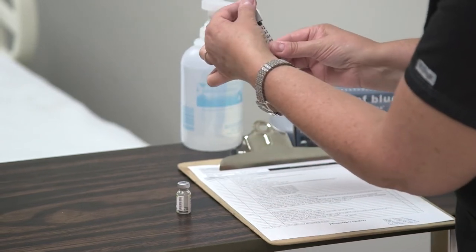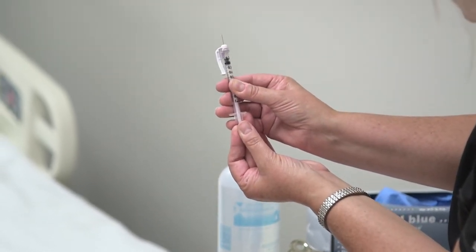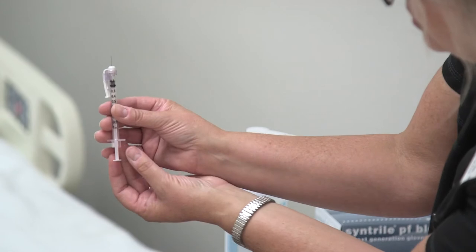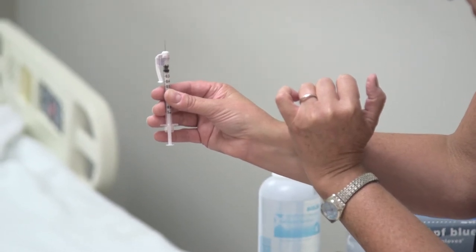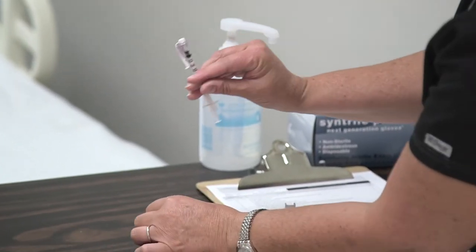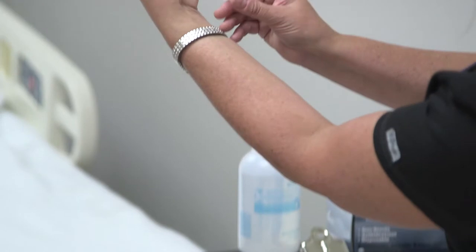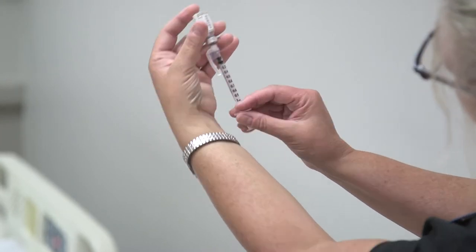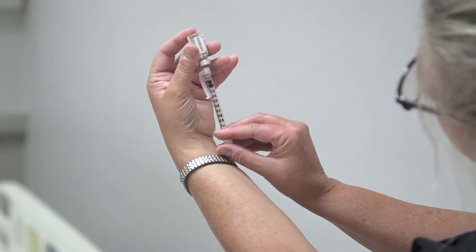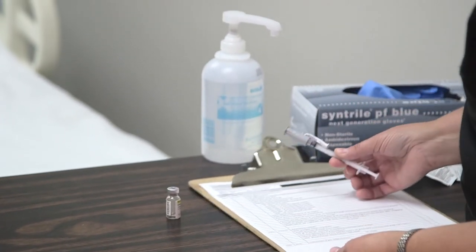Like other medications, we are going to draw up air first — just 0.1 milliliters. You can see the top of the plunger is right at the 0.1 mark. We inject the air in, then draw the medication up to eye level so you can verify your exact dose. Now we've drawn 0.1 milliliters of our PPD. We can cap the syringe safely.